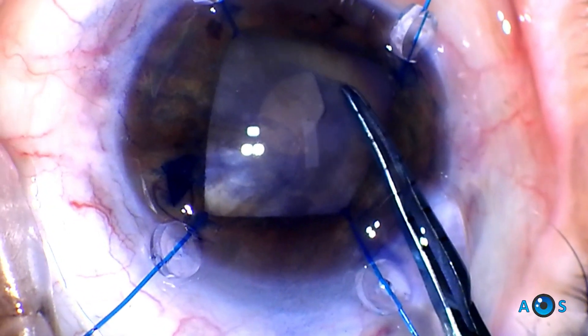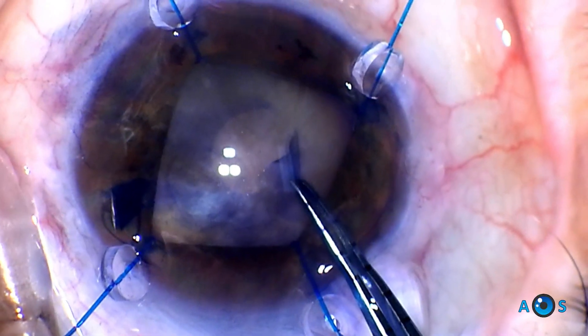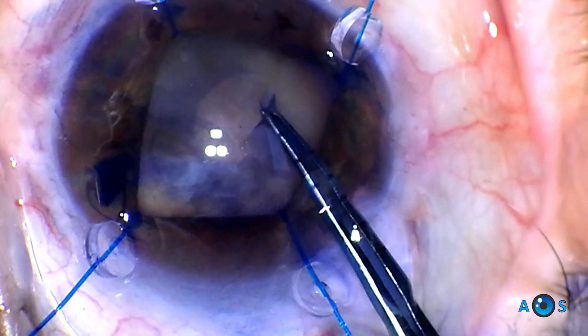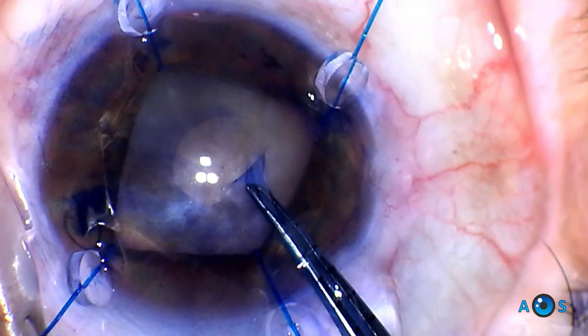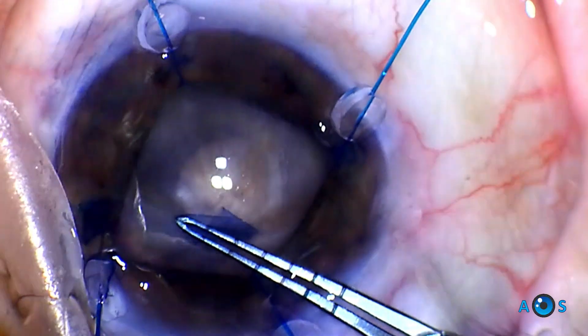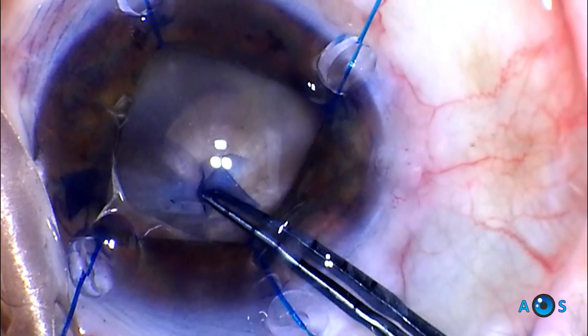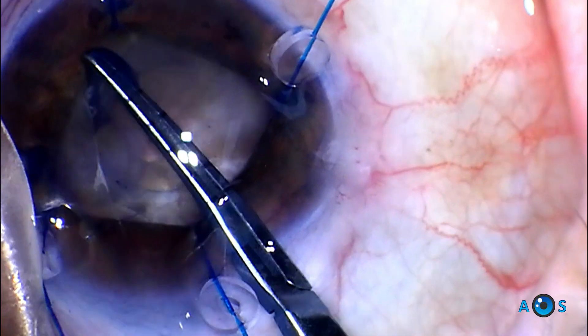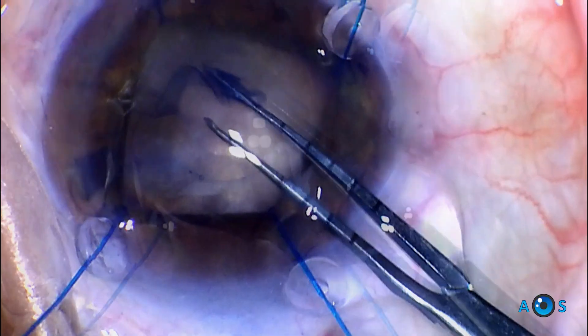Using the forceps, the capsular flap is then progressively enlarged to create a centered round capsulorhexis. This is a somewhat loose capsule due to the fragile zonules, so careful controlled re-grabs are required to complete the rhexis.